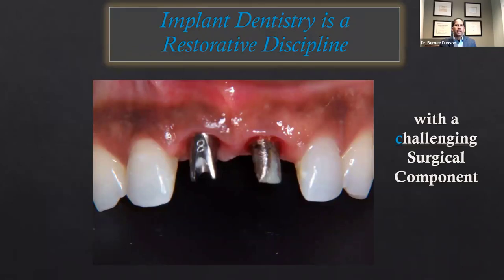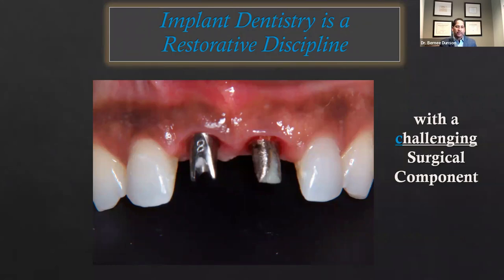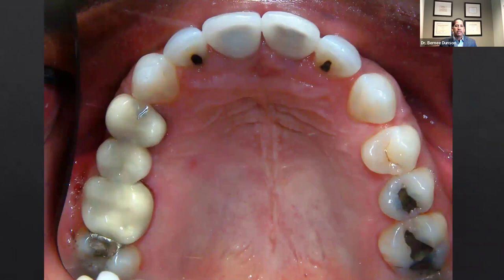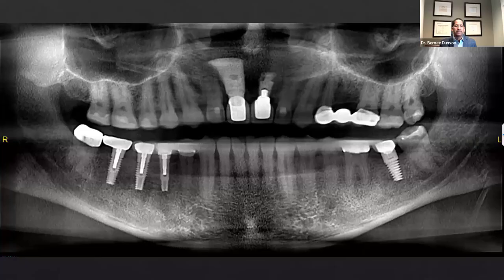Now let's jump into the challenging surgical component. This individual is a friend of mine — an NBA referee — who caught an elbow during a game and lost his two front teeth, numbers 8 and 9. He ultimately needed implants to replace them, and we created a solution where those teeth were replaced with implants rather than crown and bridge. There are many considerations when placing implants in the aesthetic zone. Here's that case in his mouth with the occlusal view.